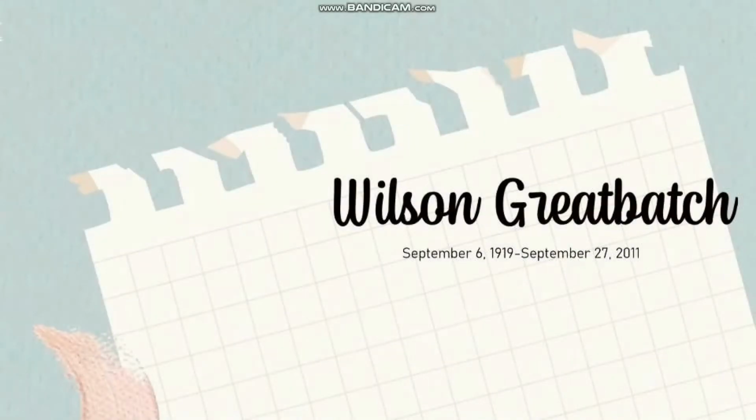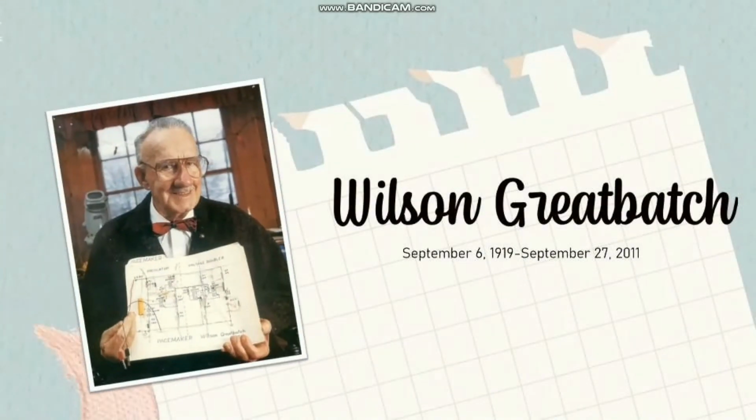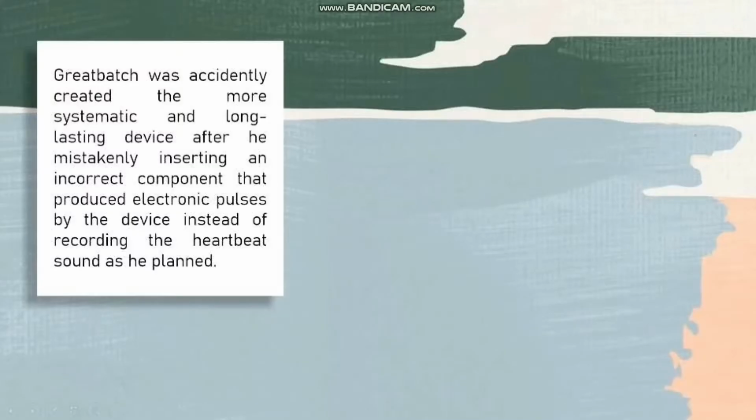Not long after that, an American electrical engineer named Wilson Greatbatch accidentally created the most systematic and long-lasting device after he mistakenly inserted an incorrect component that produced electronic pulses instead of recording the heartbeat sounds as he planned.